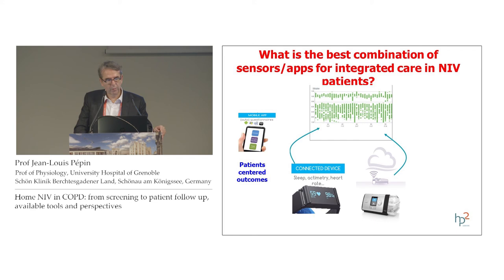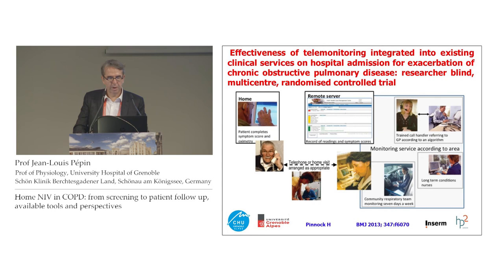We probably need more information regarding patient-centered outcomes around NIV telemonitoring. And there are now more and more telemedicine platforms around COPD care, including the follow-up of NIV. You have some remote sensors, you have some services around, including home care providers, case managers, you can call the patient. You have very different and complex systems.